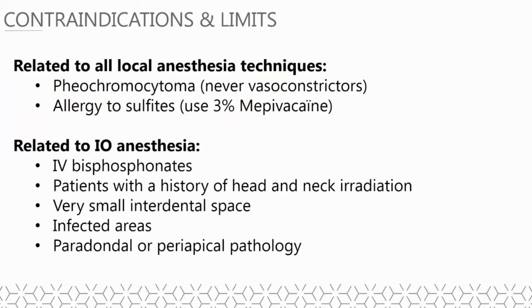For the last 3 cases, it is possible to choose a different spot remotely and increase the quantity of anesthetic to compensate for the distance to target. And it is also important to remember that QuickSleeper is like a Swiss Army knife, and when it is impossible to perform an intraosseous anesthesia, then you can switch to another injection mode and deliver a painless, conventional local anesthesia injection.